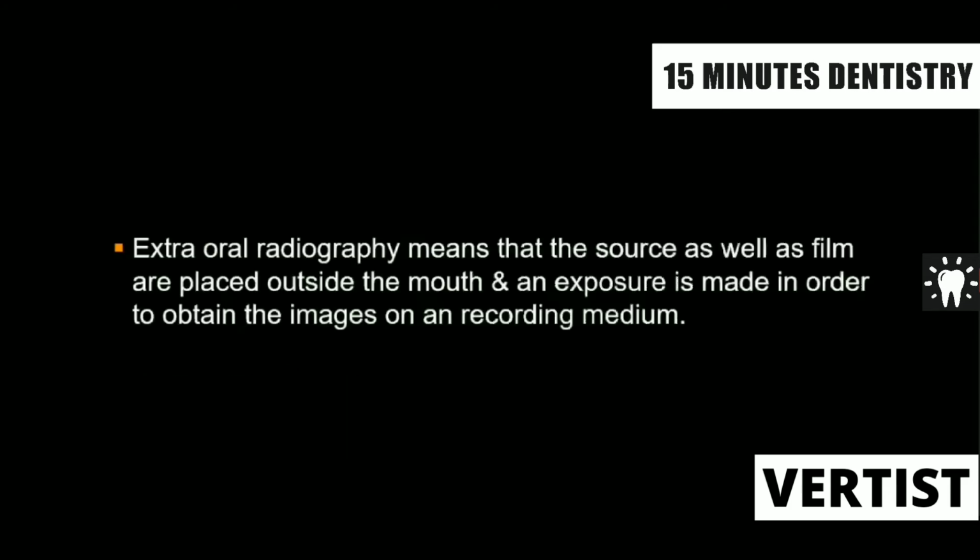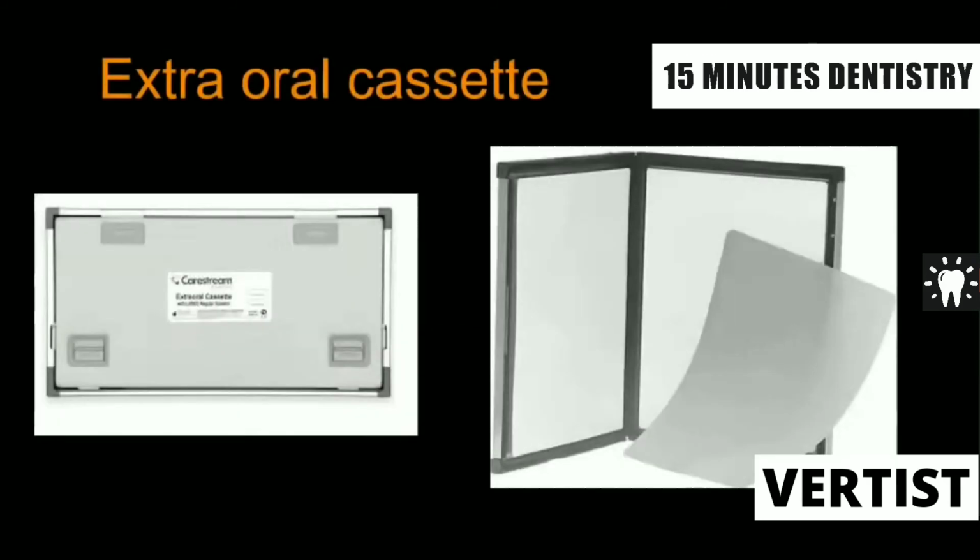This extraoral radiography, we also call indirect radiography, because here we don't expose the film directly like we do in the IOPA. In the IOPA, the X-rays pass through the object and directly reach the film, while in extraoral radiography a cassette is used and the film is exposed in an indirect way. This will always be a Viva question: what do you mean by a direct X-ray and what do you mean by an indirect X-ray? When it is intraoral, we call it direct, and when it is extraoral, we call it indirect, because the film is exposed with the help of the intensifying screen or the extraoral cassette.